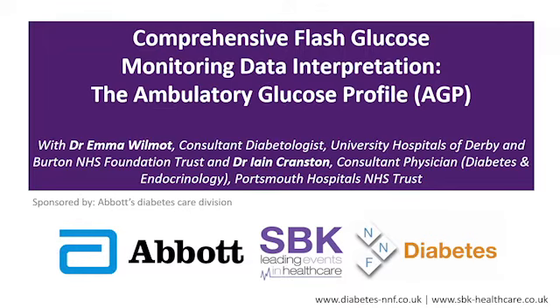Yeah, and I think we both touched on that a little bit in the webinar, didn't we? Because the figure that we tend to use by consensus for defining glucose variability nowadays is this so-called percentage CV value. And there has been some beautiful work done looking at what type of variability measure using percentage CV is, if you like, normal for individuals of different population groups, either non-diabetes or type 2 diabetes on insulin, or type 1 diabetes.